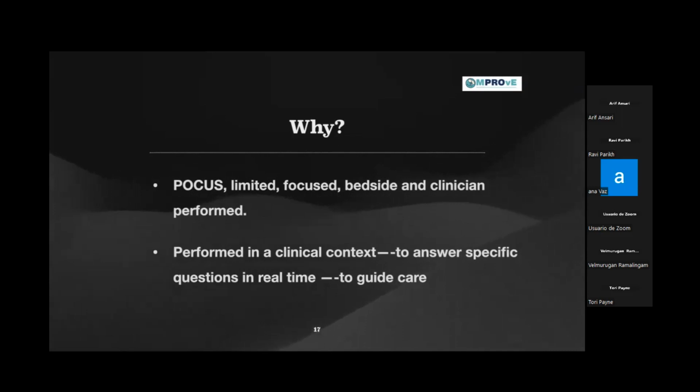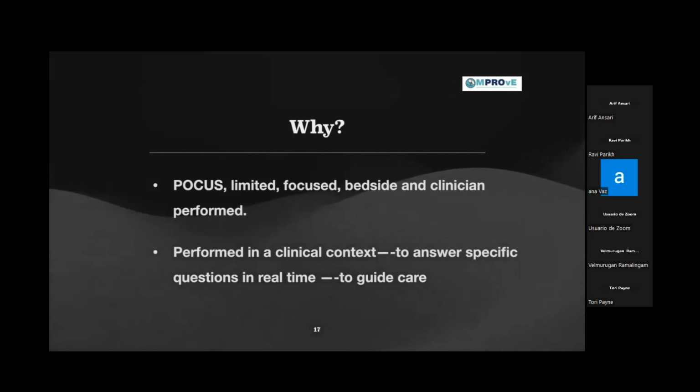So what are you going to do with this baby? You've done a chest X-ray, and on the chest X-ray it looks a bit hazy, maybe some sunburst appearance, indicating more of a TTN, but at the same time it looks like homogeneous, fluffy opacities on both lung areas, which might be a moderate RDS as well.